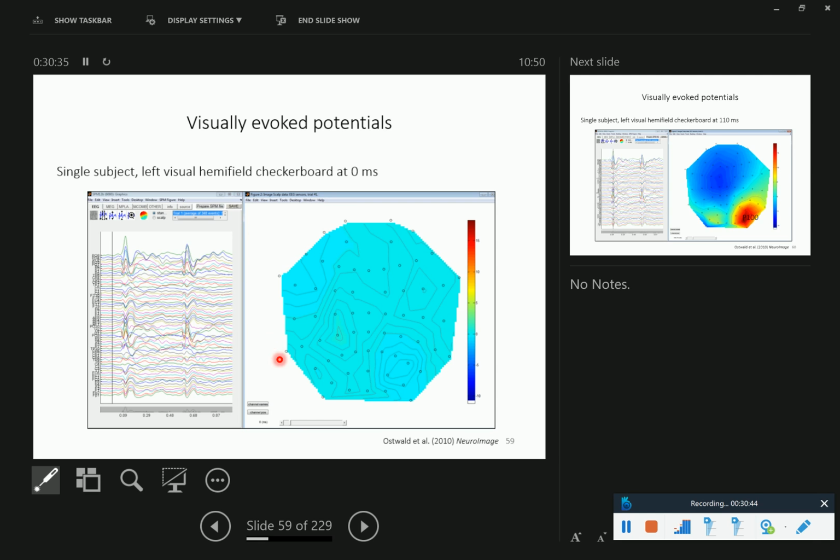So this is what we're looking at here, and we're looking at time point 0. I don't think there was any baseline correction, but there was definitely averaging. So anything that would have happened as random fluctuation over the trials has averaged out, and you see basically nothing is happening. And now we move through time. This is what I'm after, because event-related potentials are things that happen over time. So they are actually spatial temporal fields.